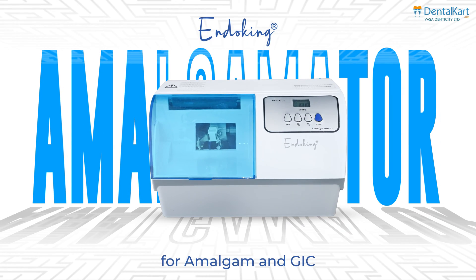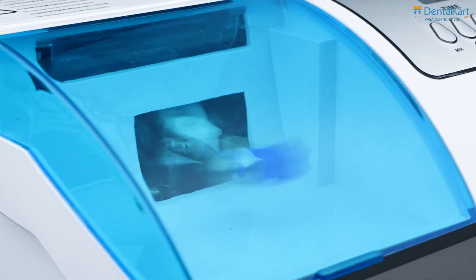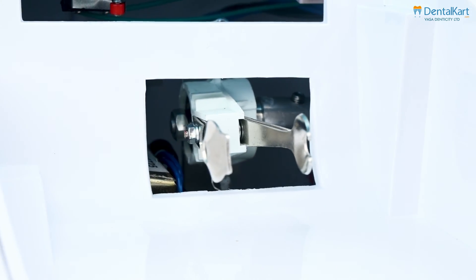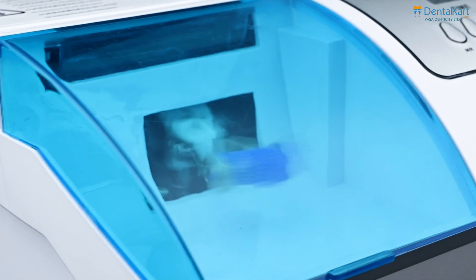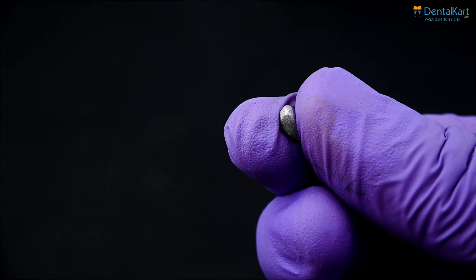The Endoking Amalgamator is designed to hold the ends of the capsule in a claw that oscillates in a figure-of-8 pattern. This design accelerates the mixture towards each end of the capsule, impacting it with the pestle and ensuring a perfect blend.